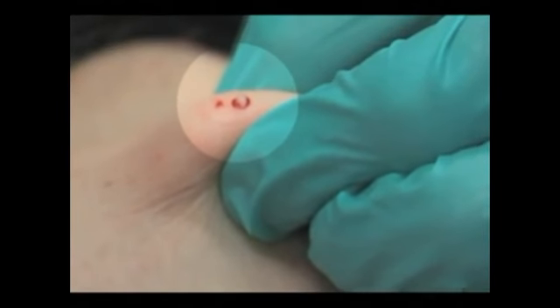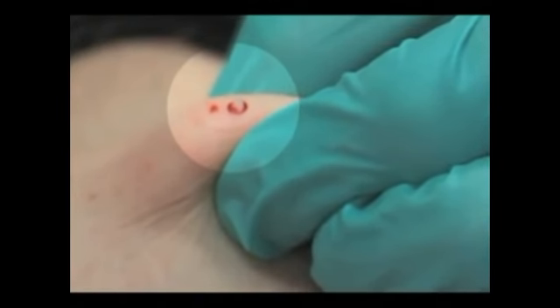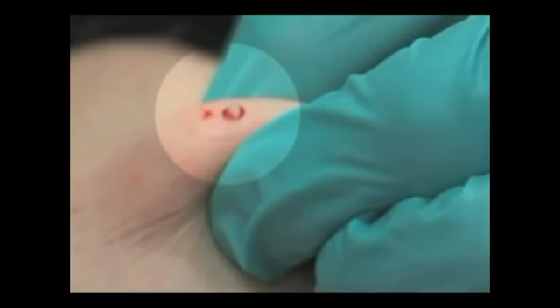In infants, the subcutaneous fat will push the specimen up, making it relatively easy to grab. Therefore, you will not need to punch much beyond the dermis.